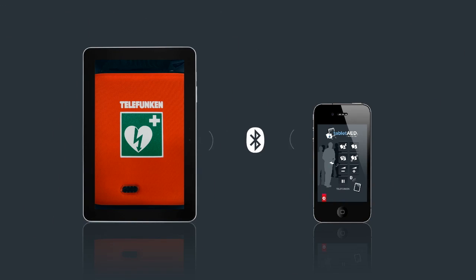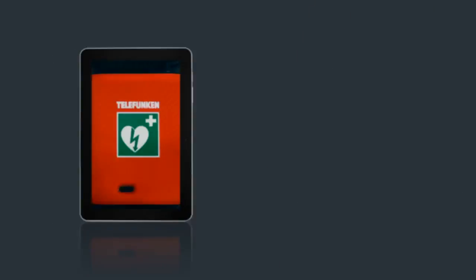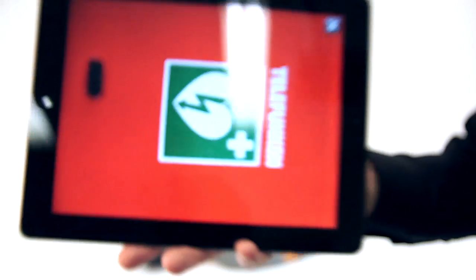It automatically starts searching for a Bluetooth connection with the Tablet AED Remote app. The Bluetooth connection is displayed on the Tablet AED Remote app and shows the selected AED at the bottom of the screen. The Tablet AED Trainer is now ready for use.